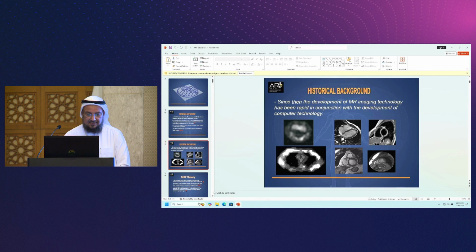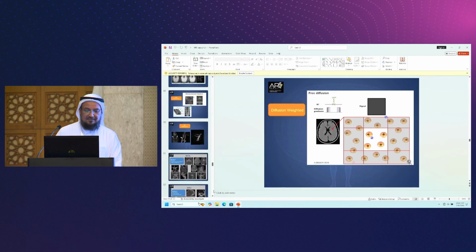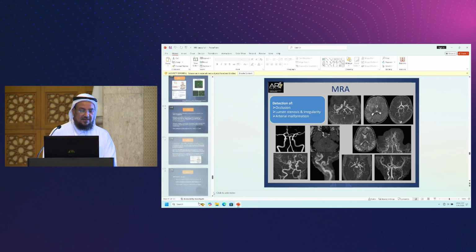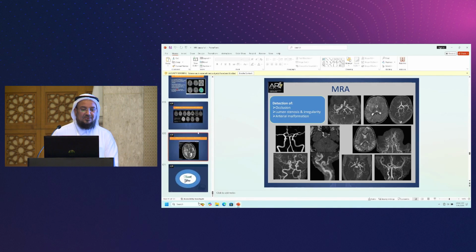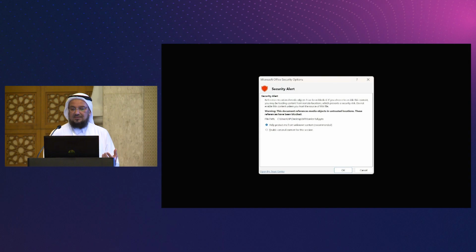Just a quick end of the lecture. As I said, MRI never ends. So many sequences have been introduced, from the point where Peter Mansfield introduced his first MR images to nowadays, where we move to what we call single acquisition, or quantitative MRI, which is the topic of my lecture tomorrow maybe. In quantitative imaging, we acquire the signal and then reconstruct it according to its T1 and T2.